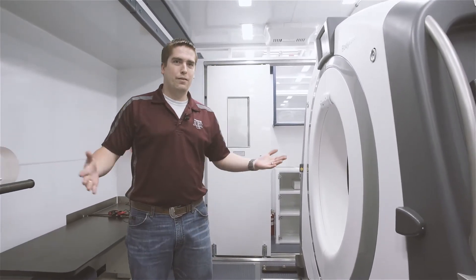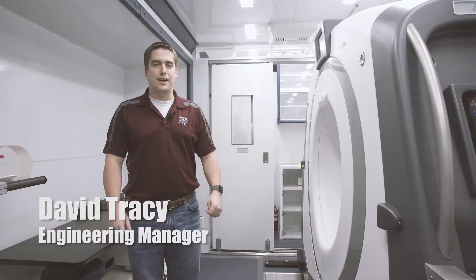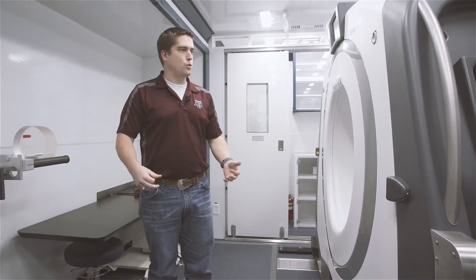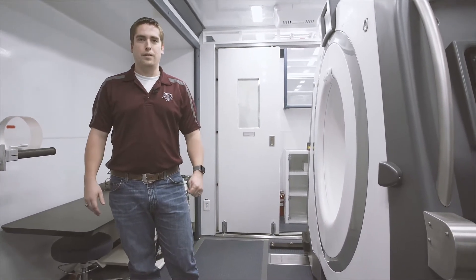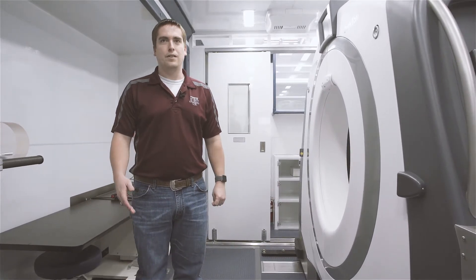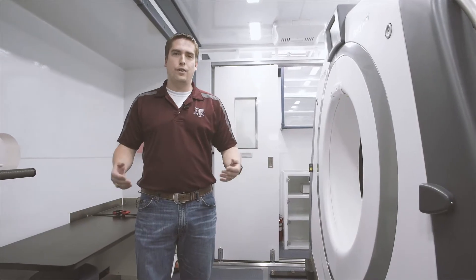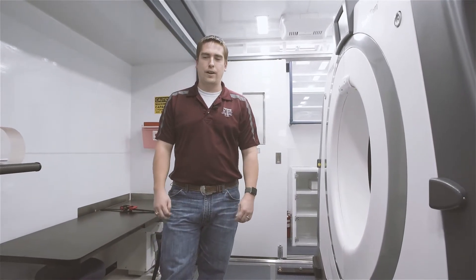Good afternoon and welcome to the interior of Fraser's Mobile Long Screen Unit. My name is David Tracy and I'm the engineering manager here at Fraser. I'm going to take you on a quick tour of the inside of this unit to point out some of the features as well as some of the safety features designed to keep the staff safe as well as keeping patient safety in mind. This is the first unit of its kind, so it's got some very unique features in here.